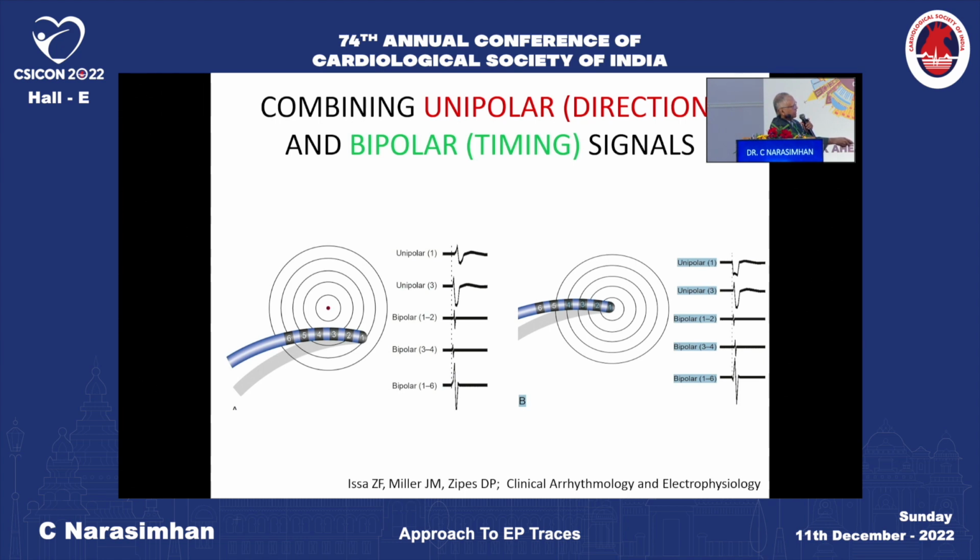I pull the catheter here and move this way or that way till such time I reach the point of origin of the impulse. So this is the way you navigate. You have a concept of a 3D geometry of the anatomy of the chamber in which you are navigating, and then move the catheter either forward, backward, anteroposterior or medial and lateral, so that you can fine tune and get this.